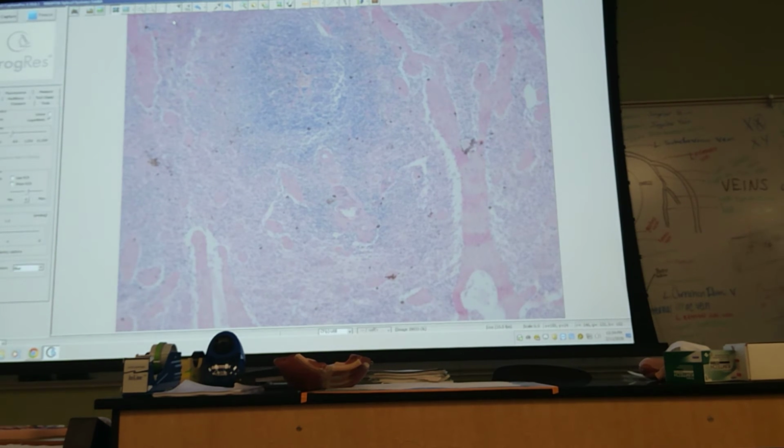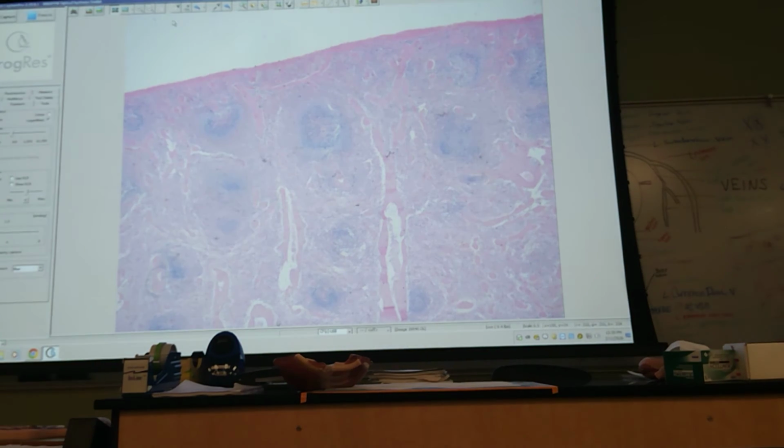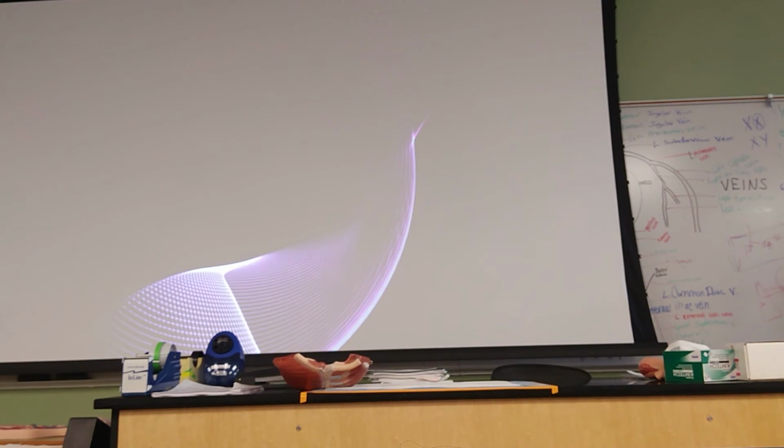All right. The other function of your spleen, to remove dead, dying, and worn out red blood cells. That's a function of the other areas. They're called red pulp. And that's any area that does not have an obvious nodule. So down here, up in here, over here, all these areas are the red pulp. All the rest, let me even go to there. Okay? We don't want that. That's not red pulp.